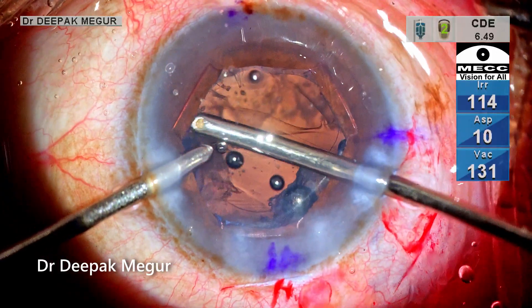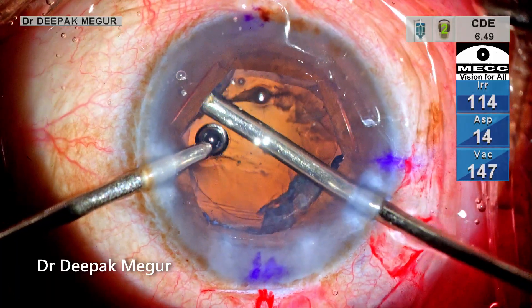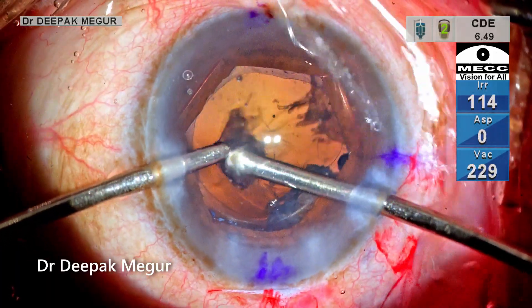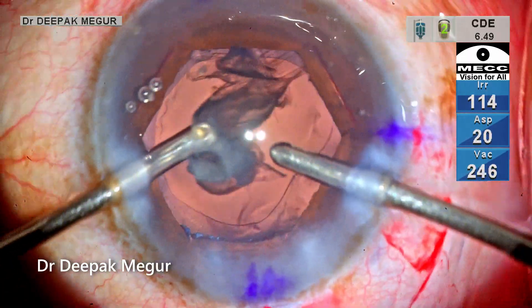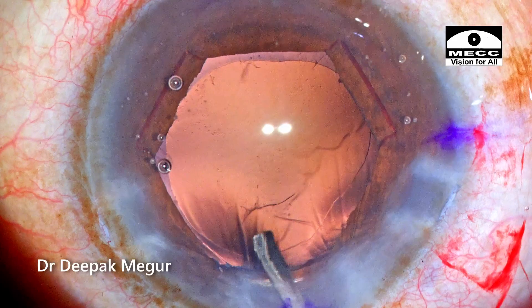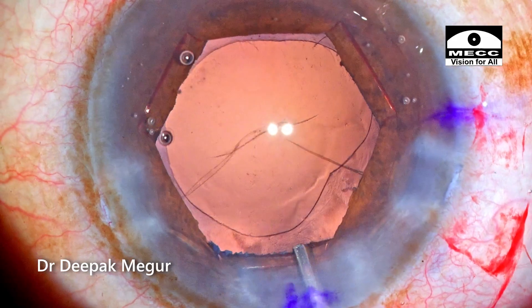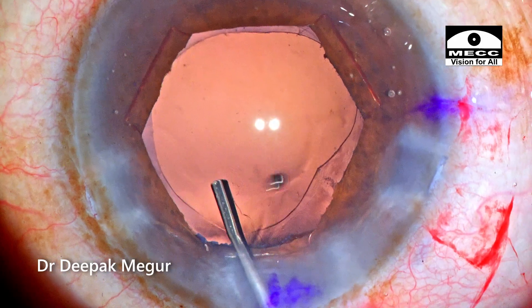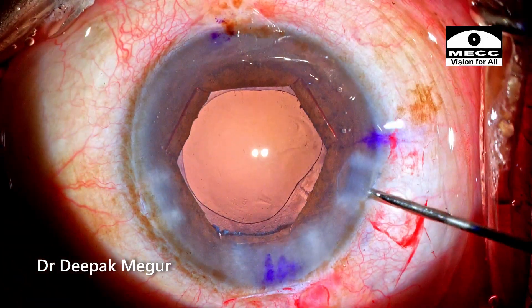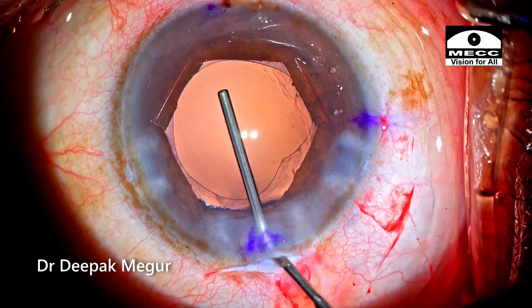The cortex is aspirated using a bimanual irrigation-aspiration device. The posterior capsule is flushed with BSS, as is customary, to ensure it is as clean as possible. I'm then injecting intracameral antibiotic — Cefuroxime — followed by injection of OVD.